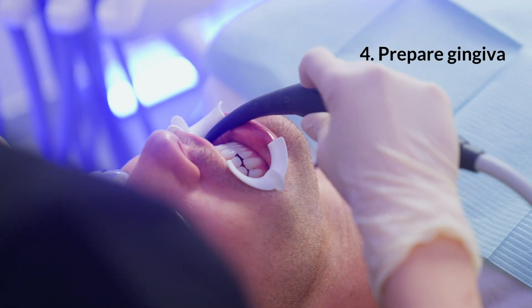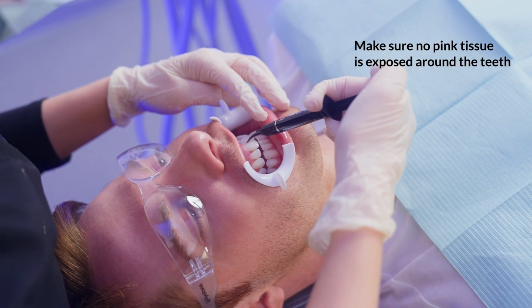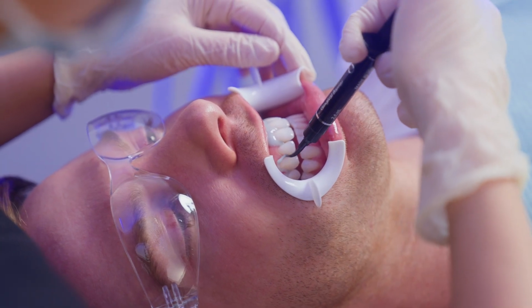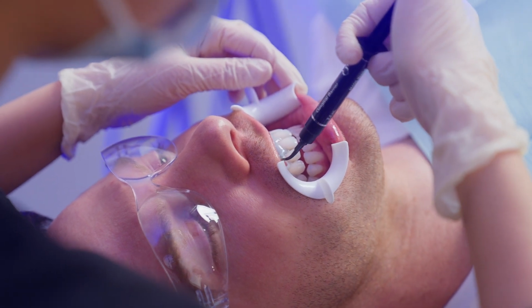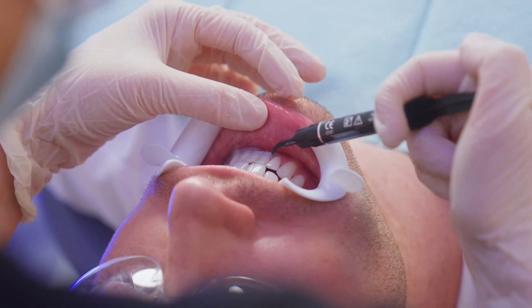Step 4. It's time to prepare the gingiva. Air dry the gum tissue on both arches, making sure it's pink, dry, and firm. Apply the gingival barrier to the gingival margin 1 arch at a time. Make sure to cover gingiva 4 to 5 mm from first molar to first molar and extend distal at least 1 tooth. If there's gum recession, please cover these areas and light cure immediately after barrier placement.